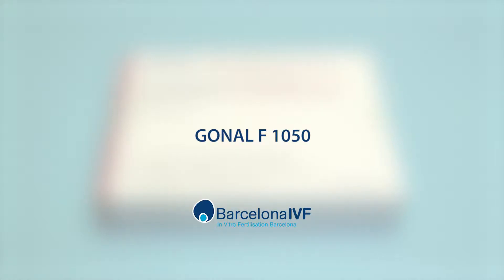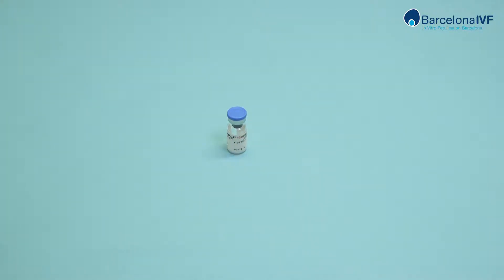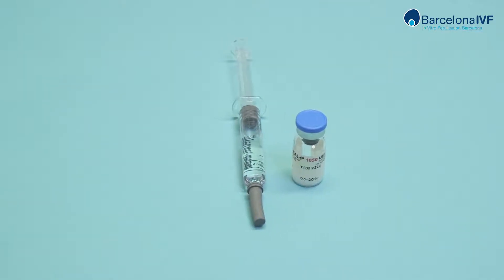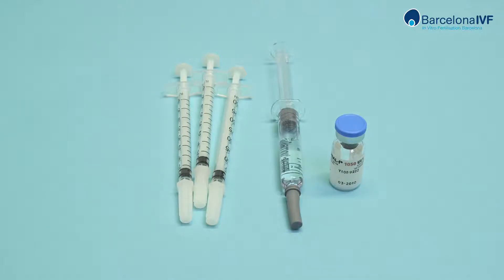GONEL F1050. Open the contents of the box and place them on the table. You will see the kit contains a powder vial, a pre-charged syringe with the solution, and various disposable needles for self-administration.